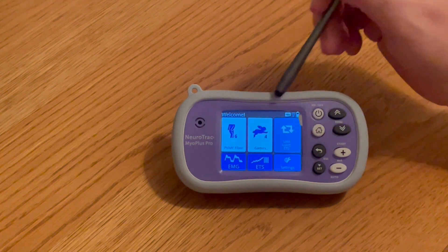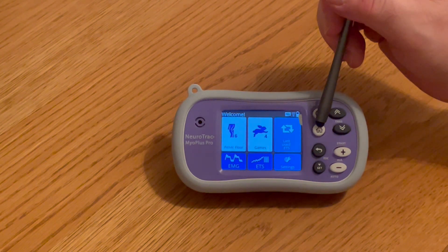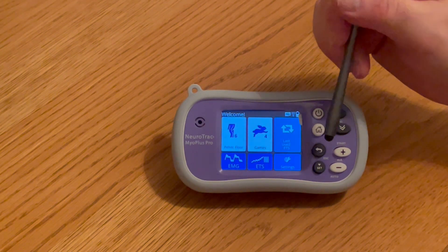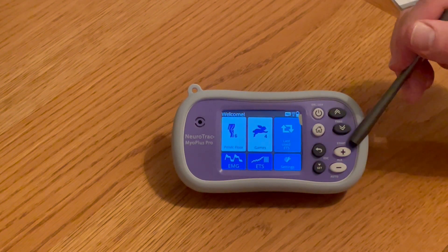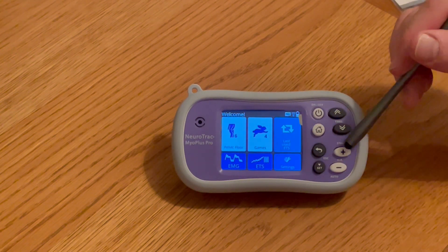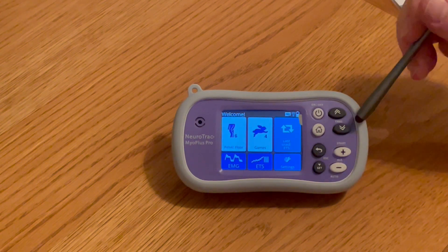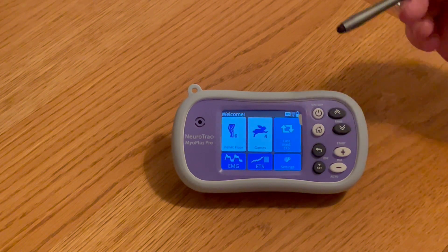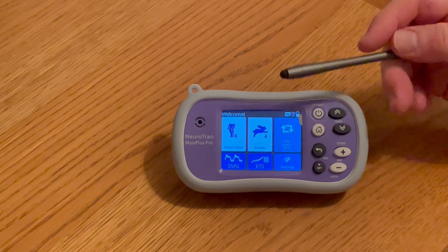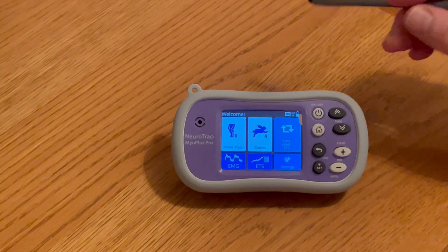On the device we have a welcome screen, our on/off button, our home screen, a return, set, and over here we have auto and start. This also controls our amplitude of the stimulation. Here are our threshold buttons, which allow us to increase and decrease the threshold where the patient has to try and attain a particular threshold by doing a contraction.